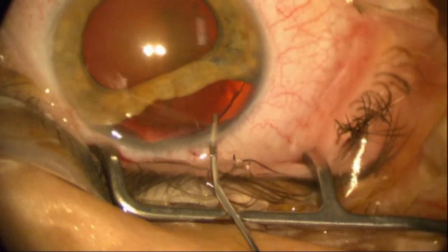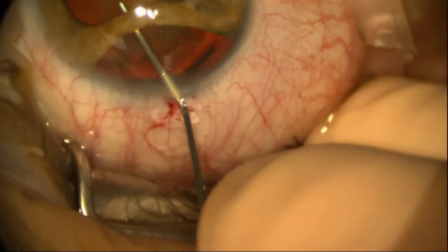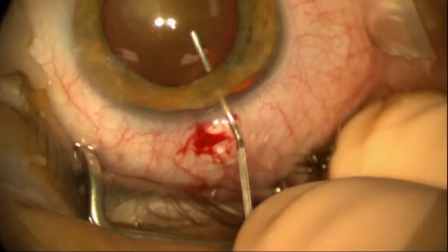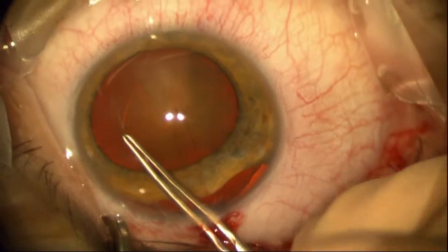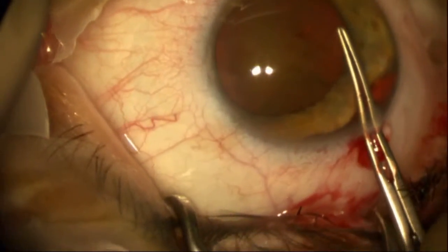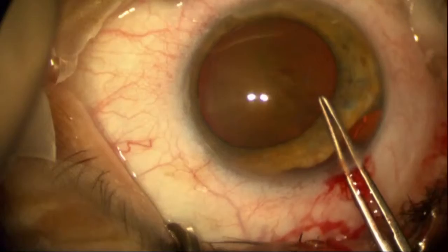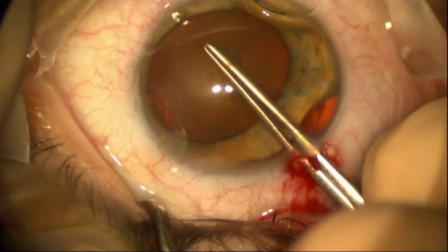Initial studies showed the lens had pretty good zonular support. Adding a viscoelastic here to move the iris out of harm's way as we get ready to do the capsulorhexis. Our emphasis is going to be to protect the iris, remove the cataract, repair the astigmatism using a toric intraocular lens, and then also repair the iris.